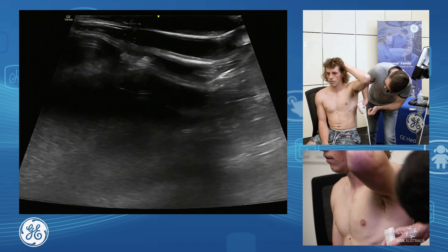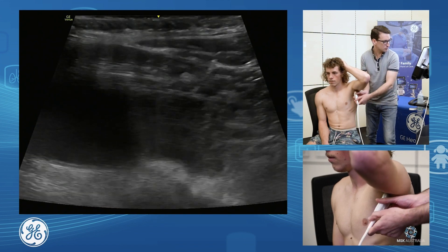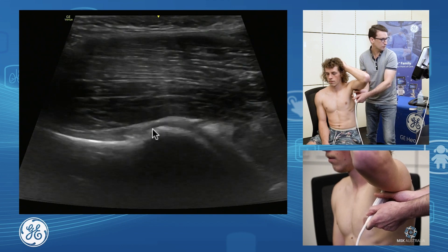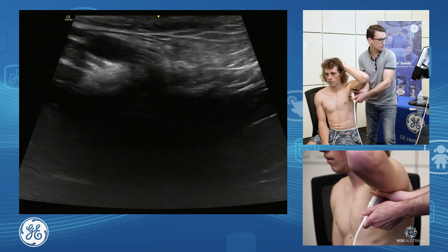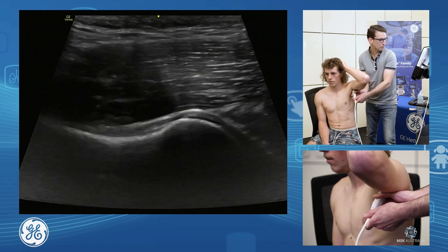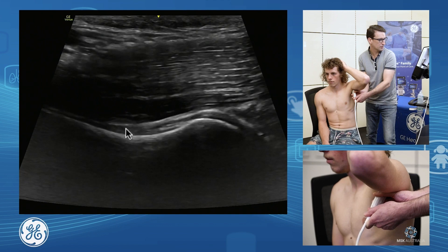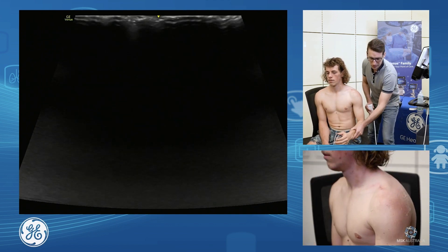All I do is as simple as eyeballing the line of the humerus and just putting my probe under the arm, moving back and forth to find the humeral head and line up. Scanning through and assessing the entirety, we want to be able to see that capsule coming over the articular cartilage and down through into the neck. That's a nice simple way of looking at the inferior joint capsule.